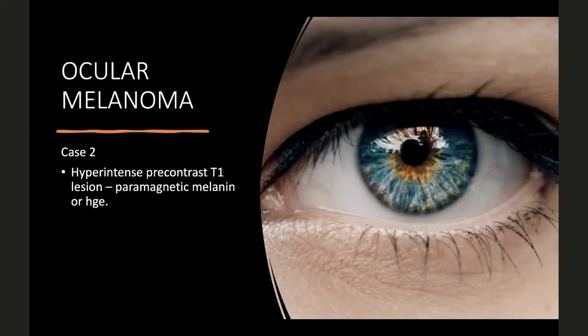So another case is an ocular melanoma where I wanted to show how on T1 certain things can be bright. We went over it in one of my first lectures to you guys about basics of MR.